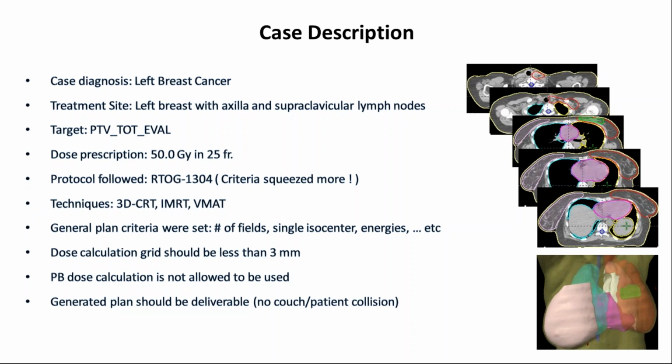The top plans submitted, I would say 95% of them, were very clinical and very practical, and the beam on time for 50, 60, 70, or even 80% of the top plans was between 3 minutes and 5 minutes.